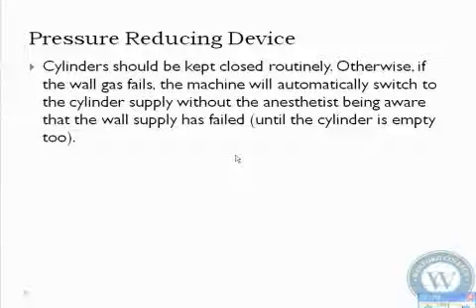The battery life, I think, is usually about 30 minutes. So they're not very long. They do take a lot of power, and you only have battery backups on the new computerized machines. Our older machines don't have internal battery backups. So the Apollo is one that we have that's a completely computerized machine. You will get to use those, and if the power goes out, you'll still have access to the machine. And 30 minutes is usually plenty of time to get more power.